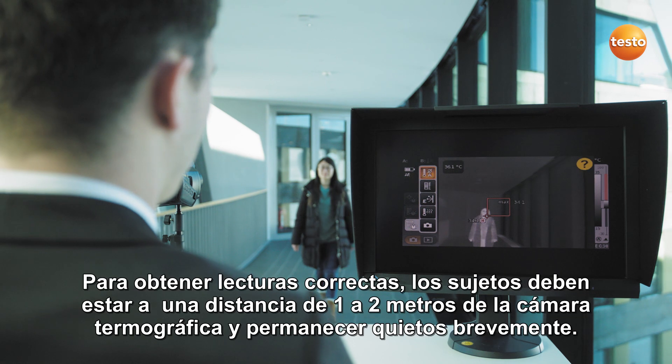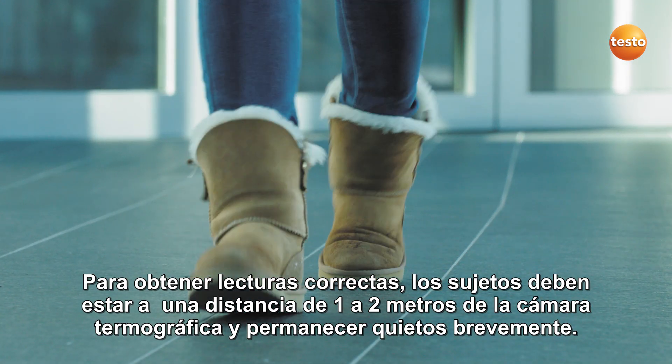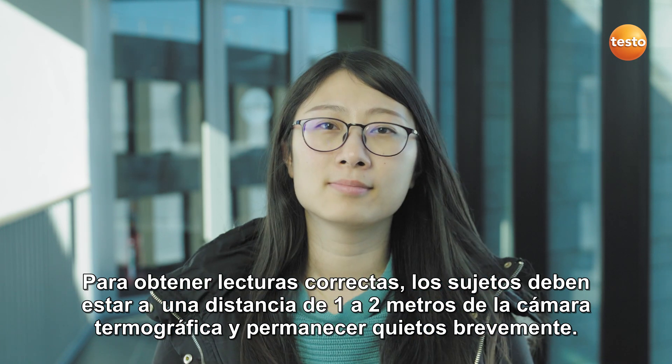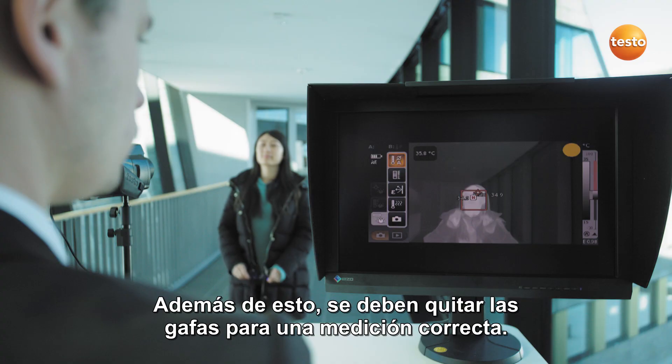The checks can now begin. In order to obtain correct readings, the subjects must maintain a distance of 1 to 2 meters from the thermal imager and briefly stand still. In addition to this, spectacles must be removed for a correct measurement.